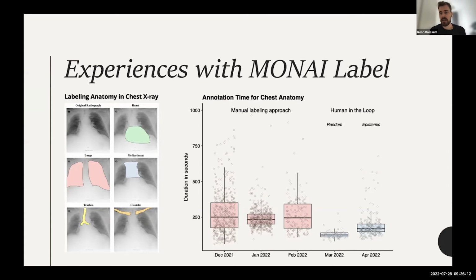We took our model, and what it does is it activates dropout during inference. So you run it several times and you get slightly different predictions. The assumption is that if it's an easy image and the model is sure and is very good, these slightly different predictions will greatly overlap. But if it's a difficult image, those predictions do not overlap. So you can calculate the score, and the lower the score, the more difficult the image is, and then you can push that forward to only annotate the difficult images. This worked really, really well.